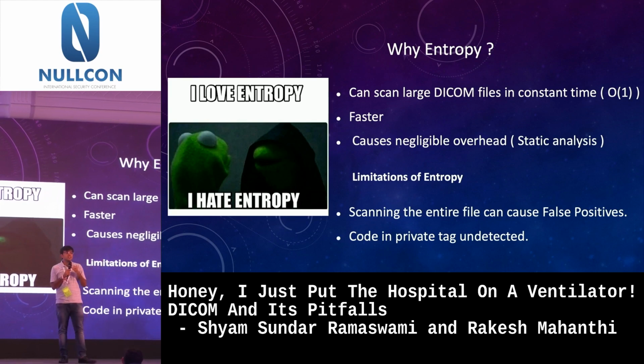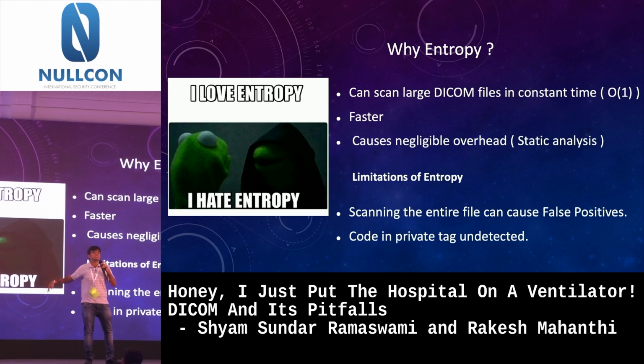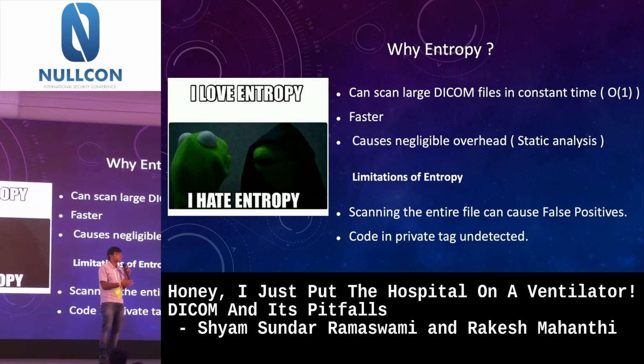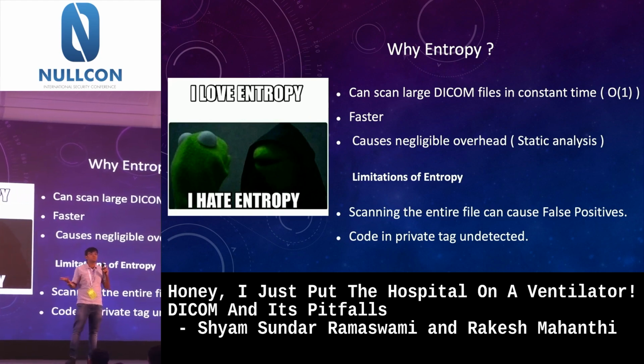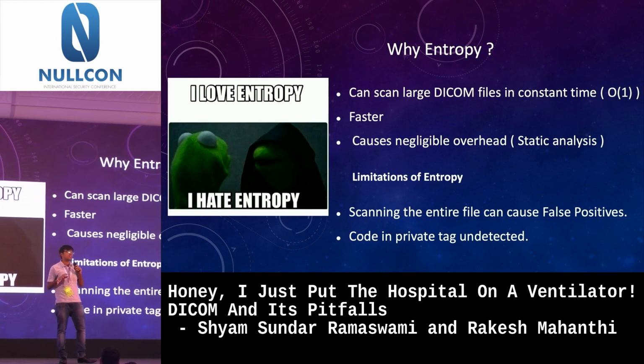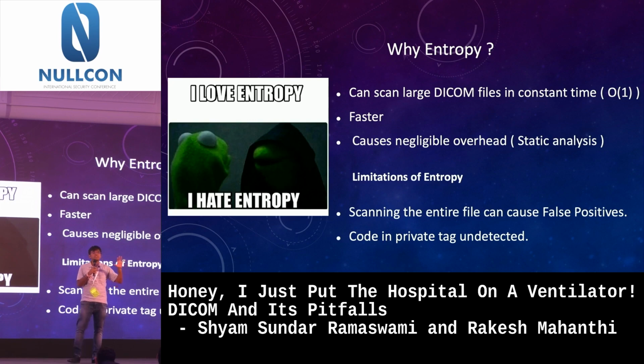First thing is, say I fake my name as a script tag with an alert message. I've uploaded the DICOM onto a web browser and someone opens it. And if that browser is running an older version which doesn't have XSS protection, then boom, hospital is gone. And unfortunately, DICOM currently doesn't have any restrictions on the stuff that can go into the standard tags like patient name and other things. So there is also a need to filter out malicious strings in the public tags as well.